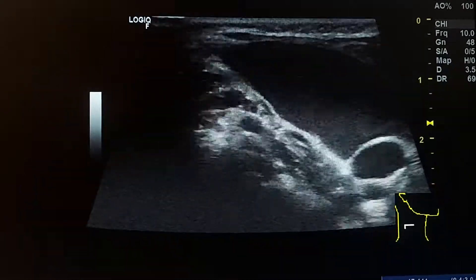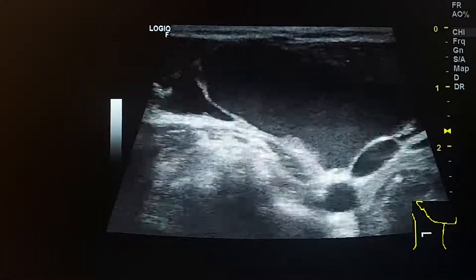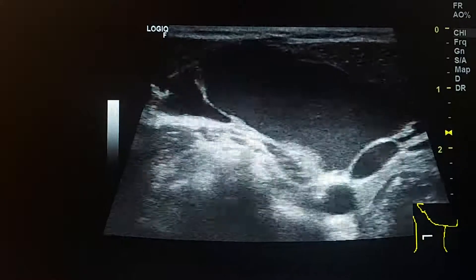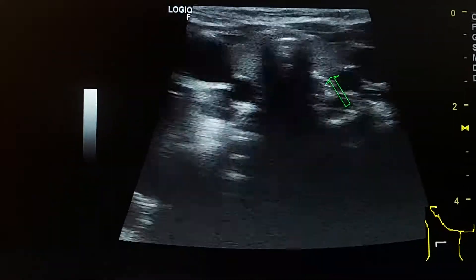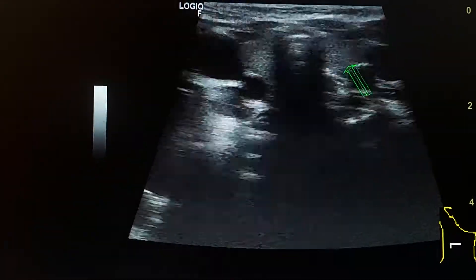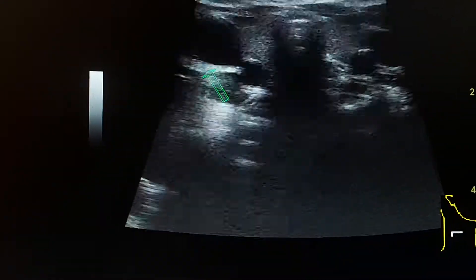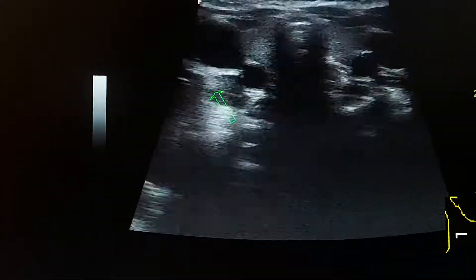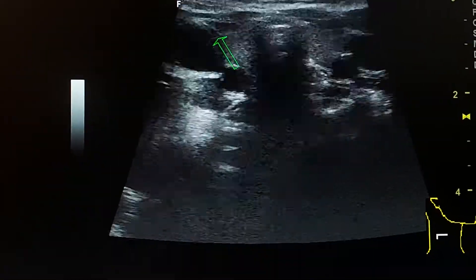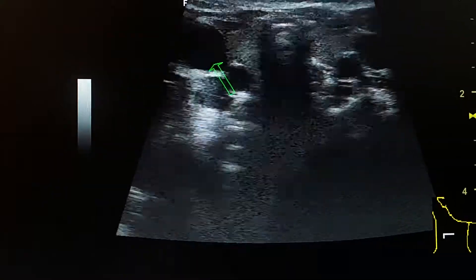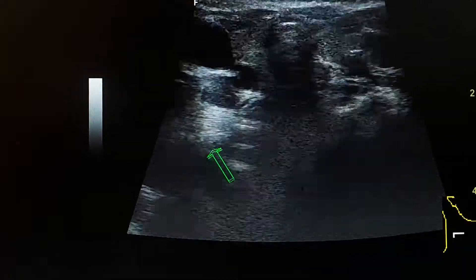We see thin septations. No soft tissue component. Here is a transverse view of the thyroid gland, and we see the lesion in the right aspect of the neck, in the posterior triangle posterior to the sternocleidomastoid muscle, occupying many fascial planes in the neck. Thank you.